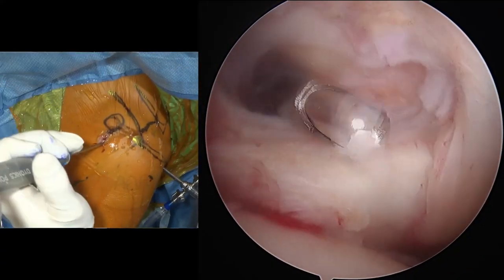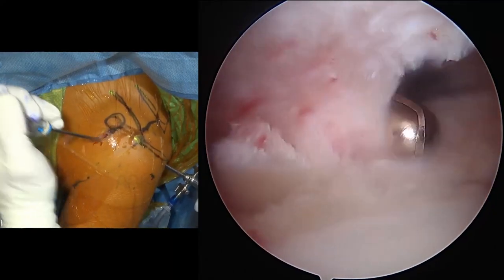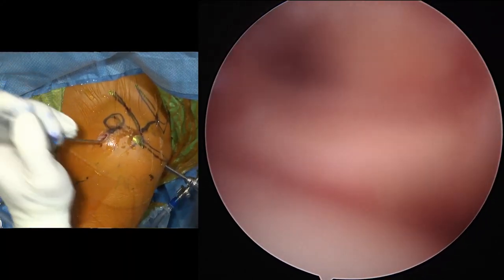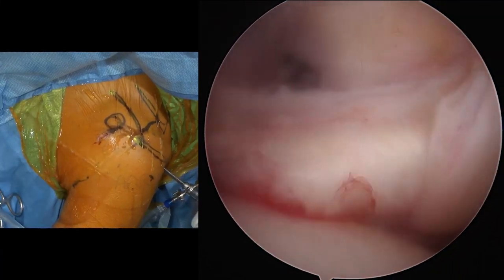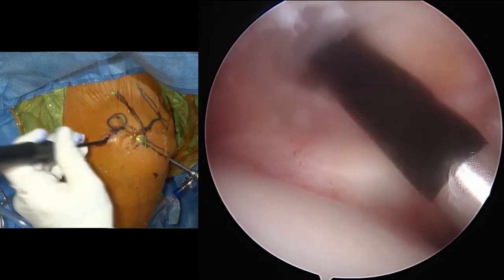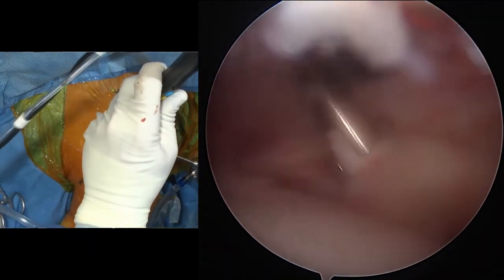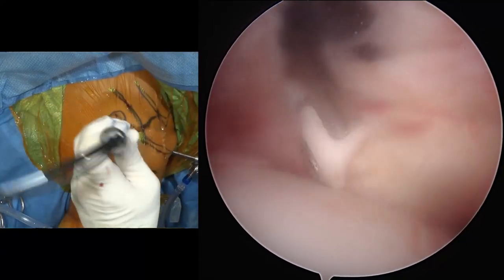Clean out his rotator interval and get a better look at his subacromial space. Have the arthrocare now, please. If we have to turn down that suction, just let us know, Greg. It's going to make a lot of noise.